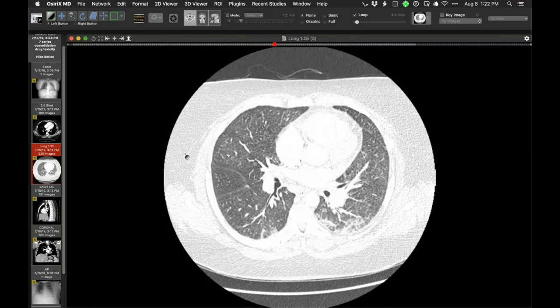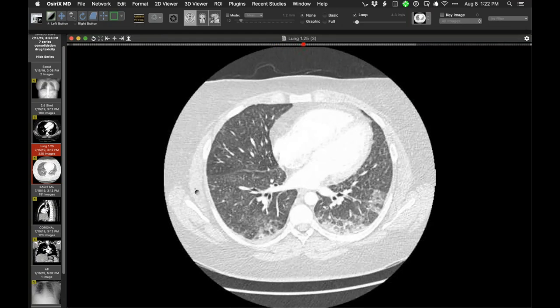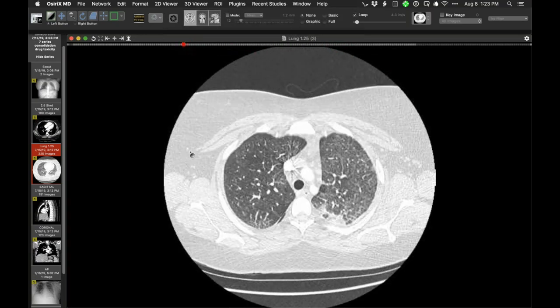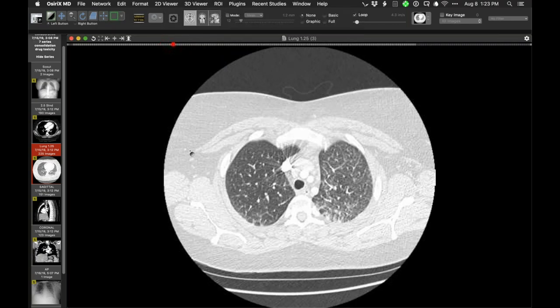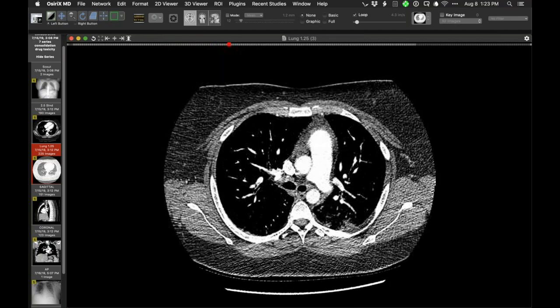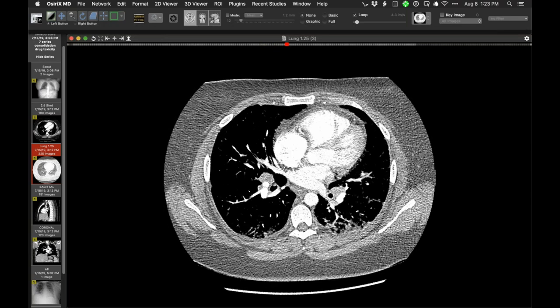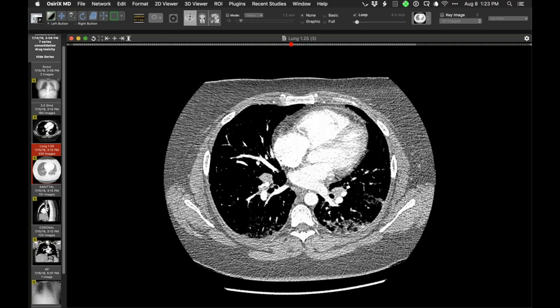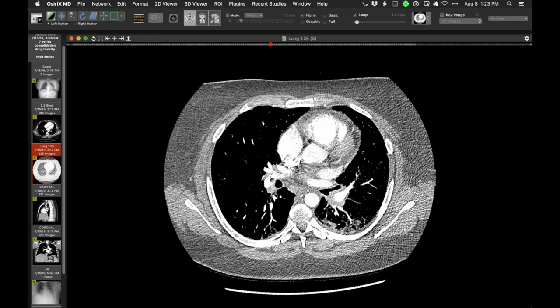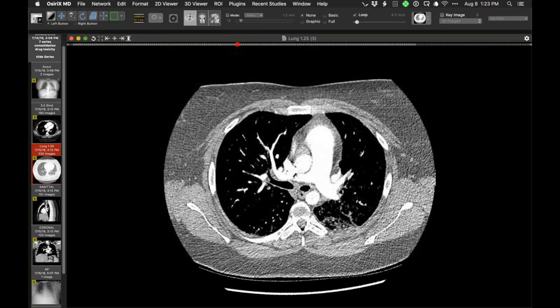The attenuation, I wonder if there's a component of air trapping going on here too. I don't know. That's very interesting. I think this person had slight lymph node enlargement, and I don't know if it's related, but these intrapulmonary lymphoid tissue down here within the lower lobes is certainly more than one usually sees, presumably reactive in some way to what's being inhaled.